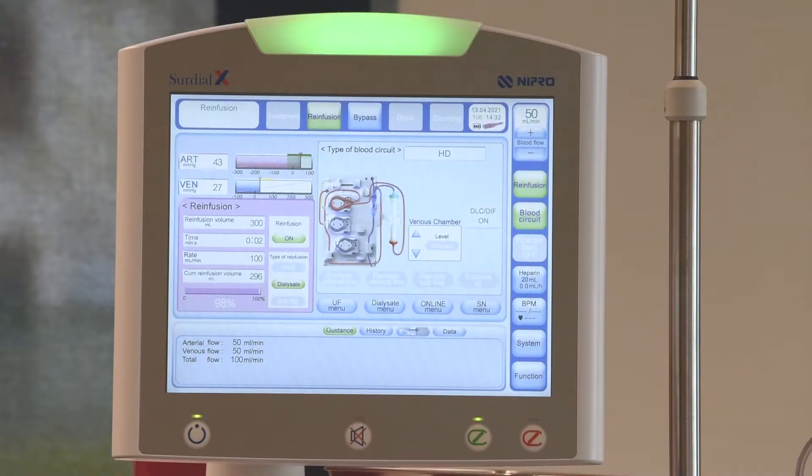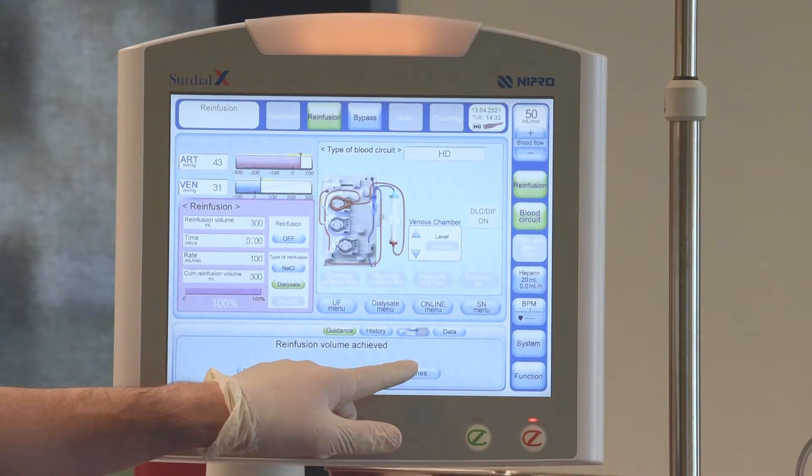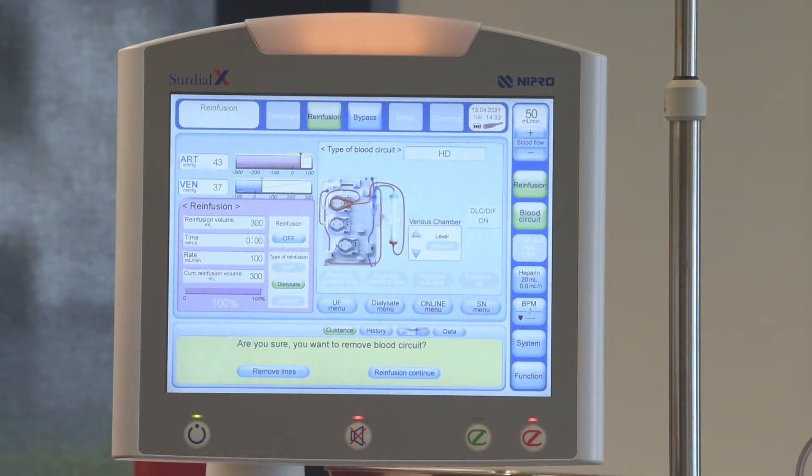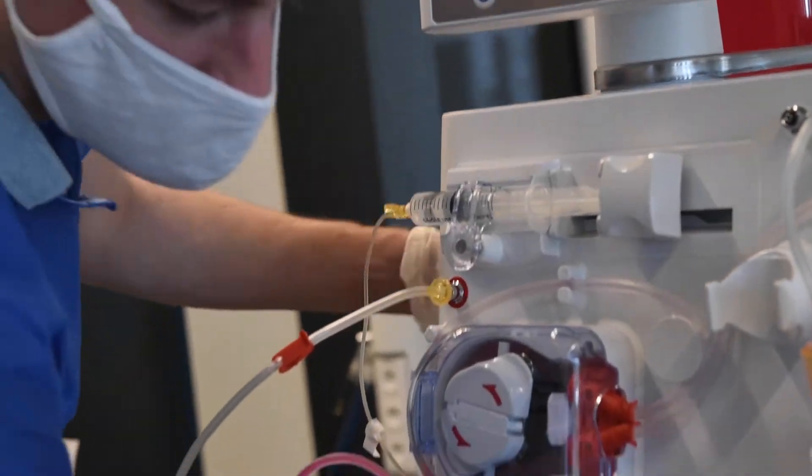If the speed is changed, observe the overall speed in the guidance box. When the re-infusion volume has been achieved, the user can choose to continue re-infusion or remove the blood line. Continue will add 100 ml of re-infusion volume. This step can be repeated as necessary.